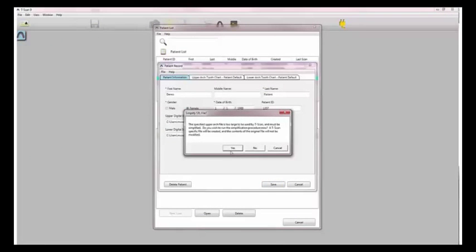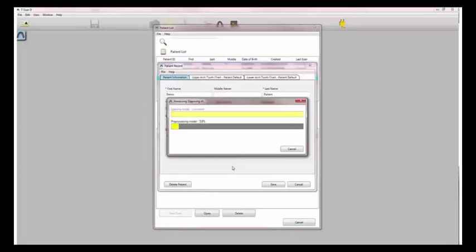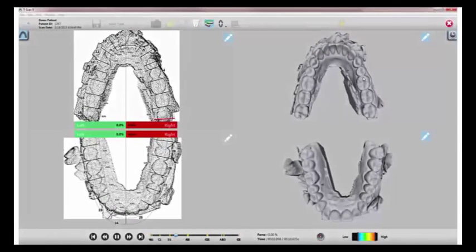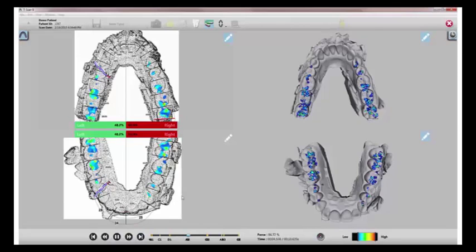T-Scan software now gives you the ability to import digital impressions from your intraoral scanner. The same 2D and 3D displays showing force and timing of contacts now appear as a digital impression overlay showing contact locations across both arches. 2D and 3D lower and upper arch views provide a dynamic outlook on the contact points when a patient occludes on the T-Scan sensor.